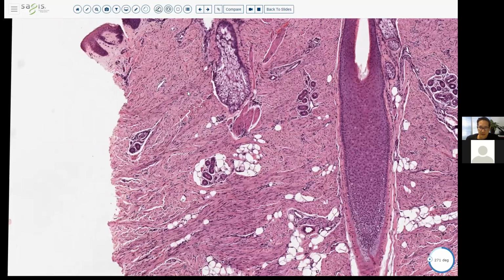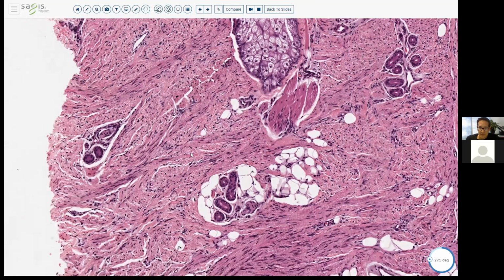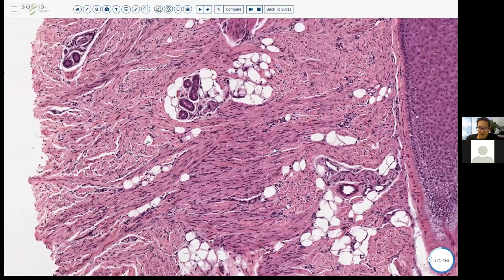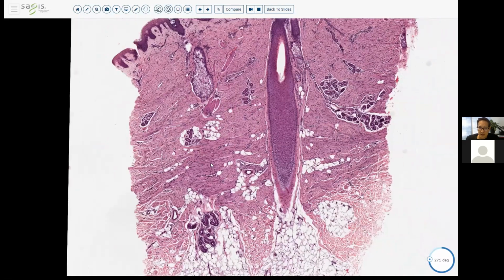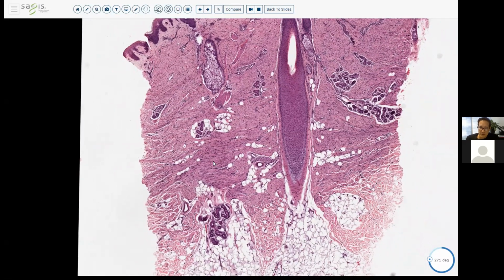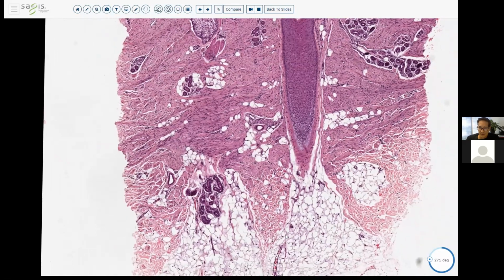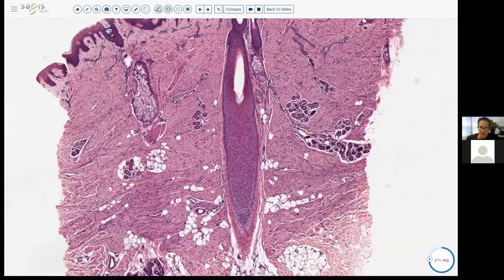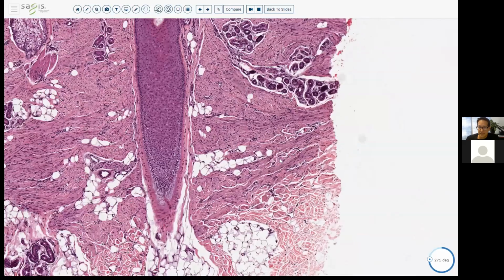The cytoplasm is quite pink, okay? But the nuclei are small, spindled, kind of wavy, okay? And they taper at the edge. But notice how pink this cytoplasm is. It's really this horizontal pattern that clues you into what this is. This is a dermatomyofibroma. So somewhat related to the dermatofibroma, except in this case, the cells actually have a smooth muscle aspect to them. It's benign, okay, and it again should not invade deep into the subcutaneous fat. So this one is mostly in the dermis. And these will stain for smooth muscle actin. And hence that's where they get their name, dermatomyofibroma.